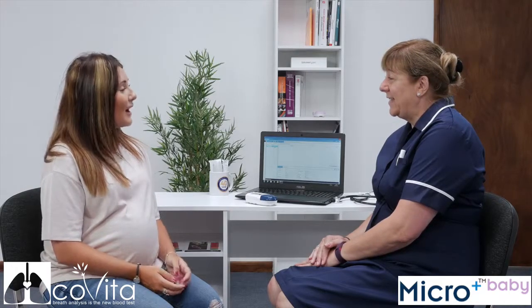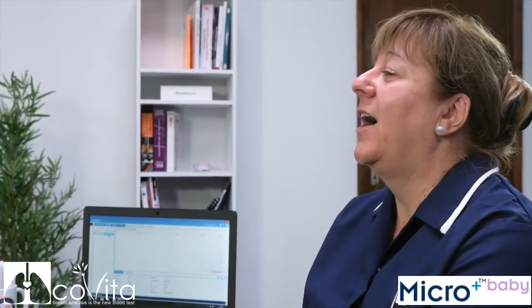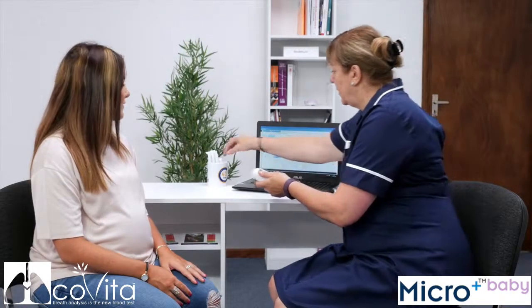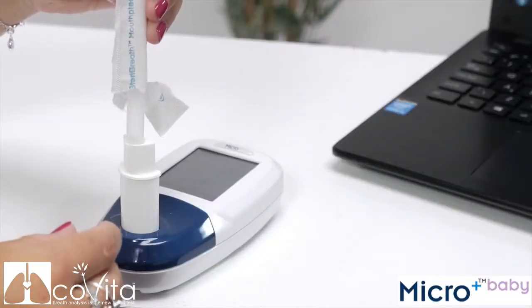The maternity breath test has been designed to help mums-to-be quit smoking. By measuring the CO levels on a pregnant patient's breath, the Micro Smokerlyzer can also calculate the amount of harmful CO affecting the baby. To take a maternity breath test with the Micro Smokerlyzer, first attach the D-piece to the monitor, and then the SteriBreath to the Micro.